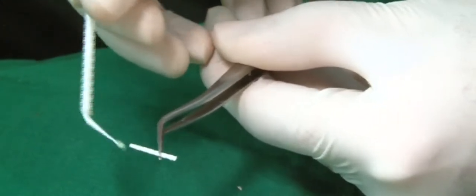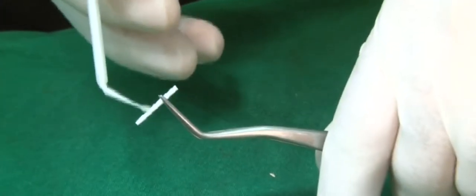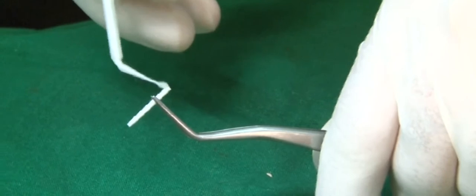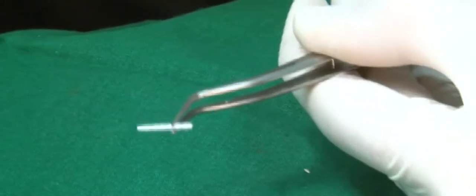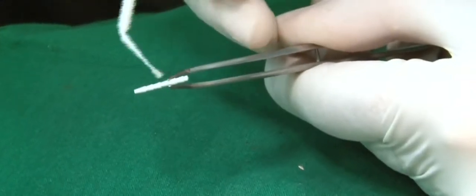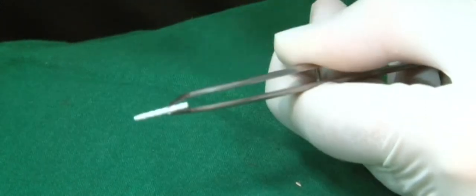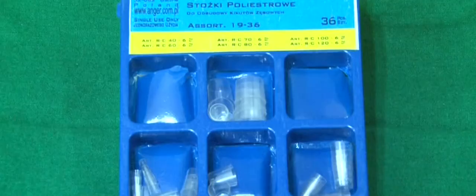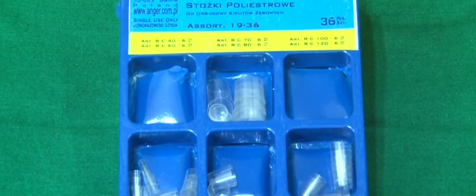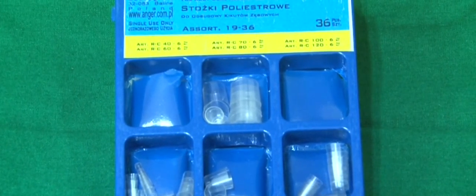Simultaneously, an appropriate size of core former is selected, which helps in building the lost tooth structure on the post. These core formers are preformed crowns which are available in various sizes.